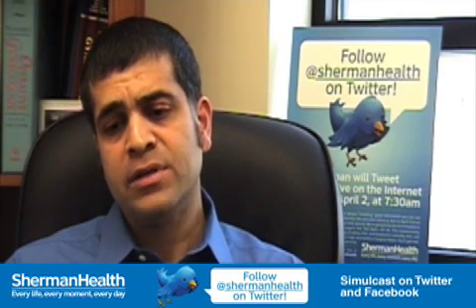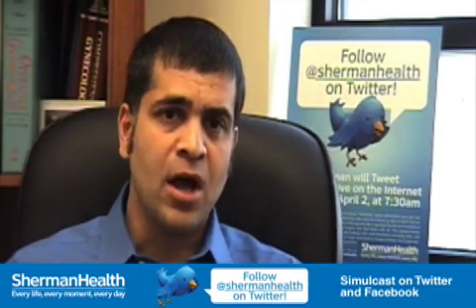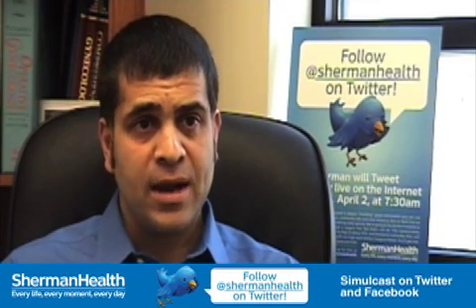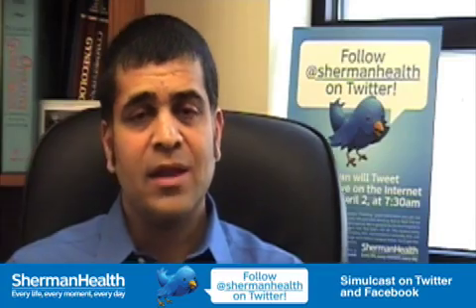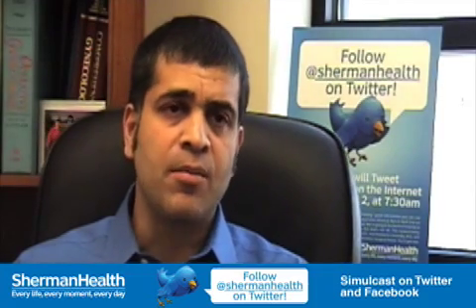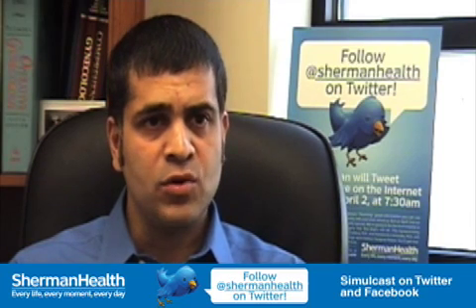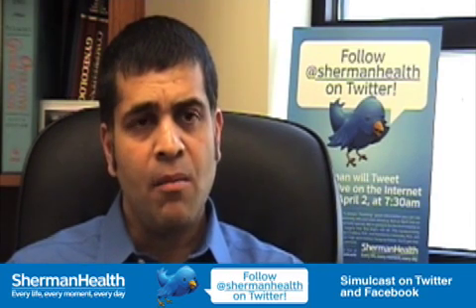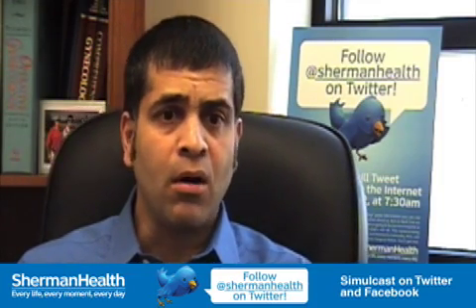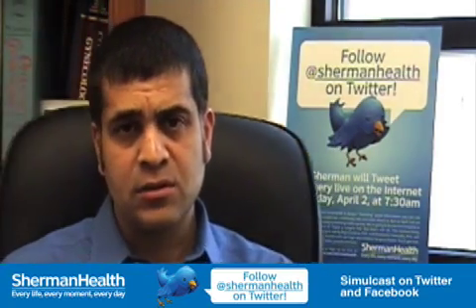Whereas if the assistant surgeon is not around, then I'm not next to the patient, I'm sitting at the console, then I would have to go quickly scrub and then get to the patient. And I would still do that anyways, but it would take me a few more minutes than having an assistant surgeon right there. The other benefit is that if you have a surgeon who's operated with you for many years, like Dr. Lamut has, he knows exactly what I'm doing, so he can help me out better too, by pushing different instruments in or holding things out of the way, or helping me along with the surgery. Okay. So it's always good to have an assistant surgeon around.